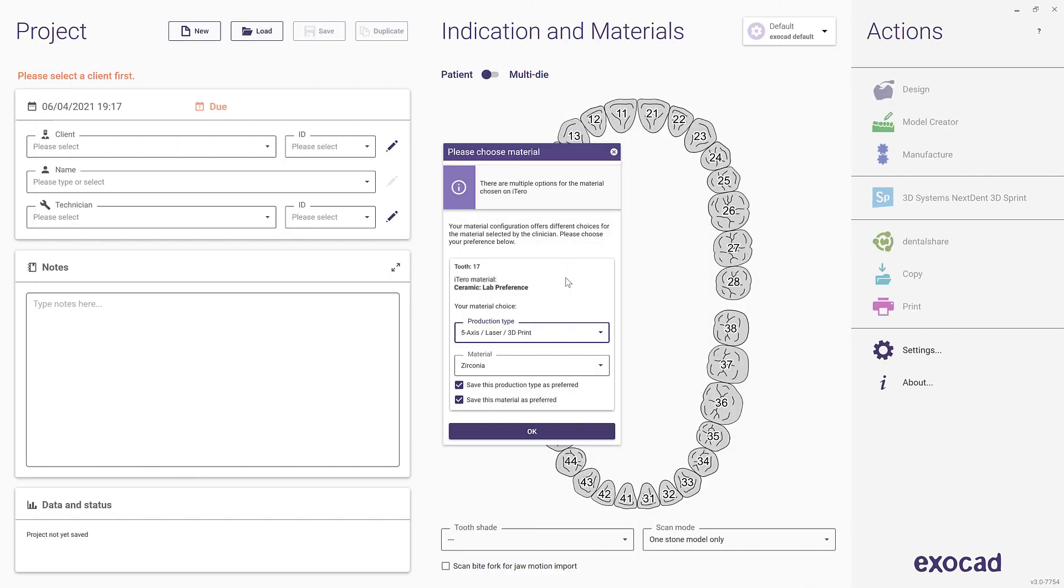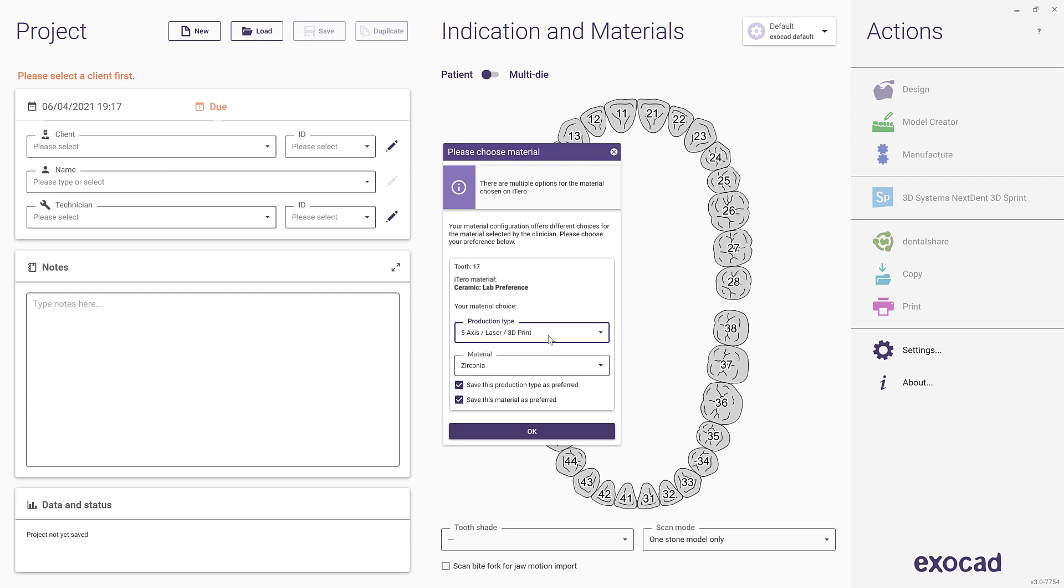The materials chosen on the iTero scanner are also mapped to the material list in your ExoCAD software. This mapping can be customized to a certain extent. When you import a case where the material mapping is ambiguous, you will be prompted for your preferred choice of materials for this case. There is also an option, enabled by default, to make this choice the default for future imports of cases with the same material.